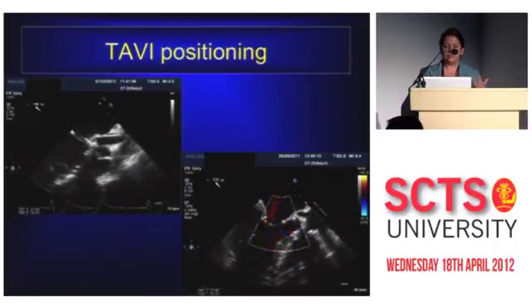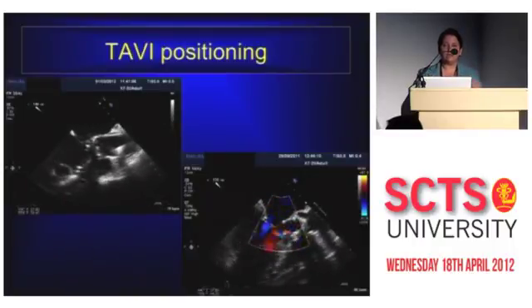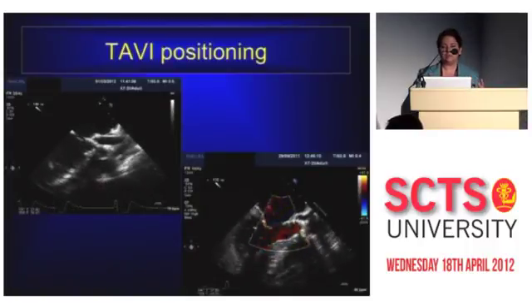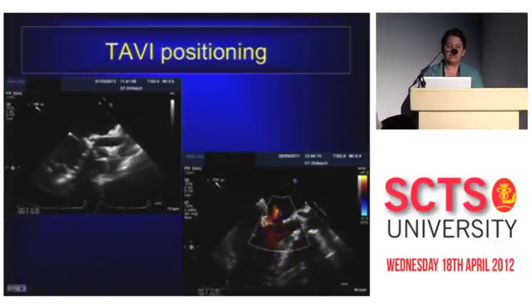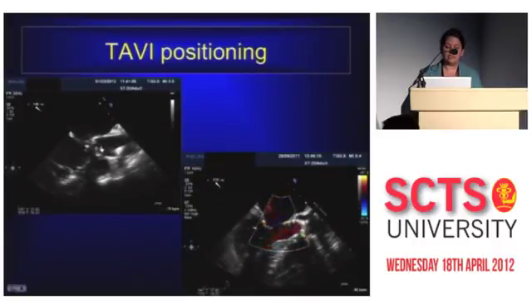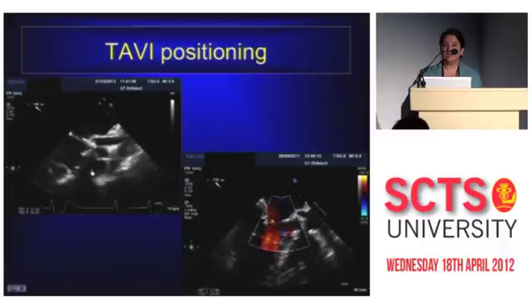This procedure is, a lot of it, still fluoroscopy based. It's not like the MitraClip. The MitraClip is very much echo based, but with the TAVI procedures a lot of it is still fluoroscopy based, but the initial positioning before you commit the valve is actually quite important from echo. So here you can see that there's a guide catheter and most of the CoreValve is inside the delivery system, but the distal end, the LV end, has started to come out now, and you can just see the mesh opening up slightly, and this is about a third deployment.